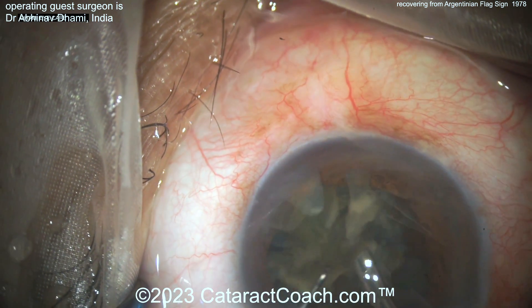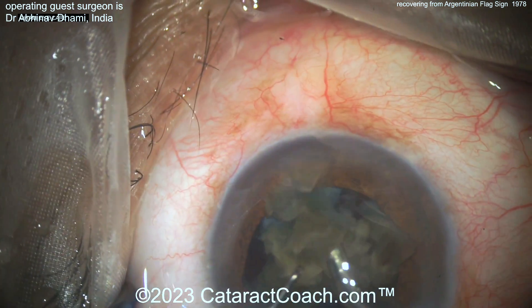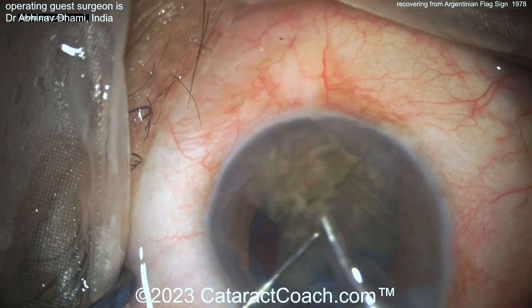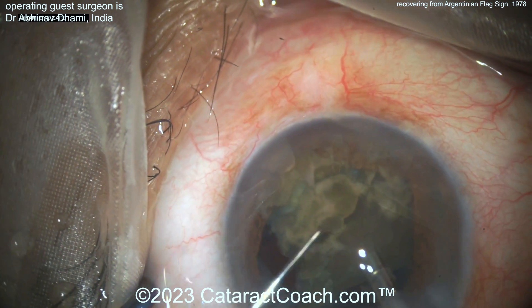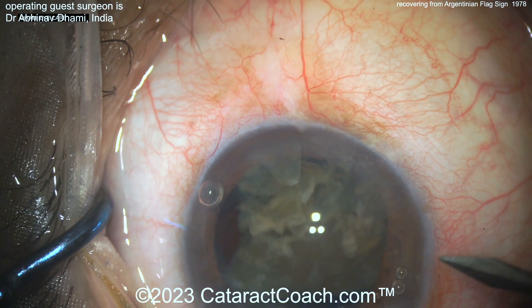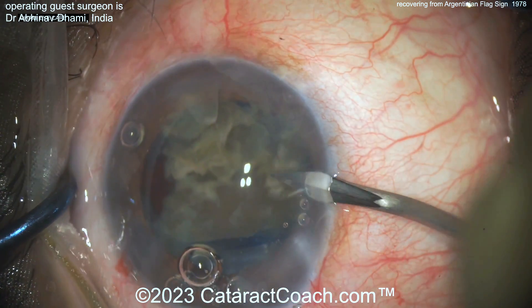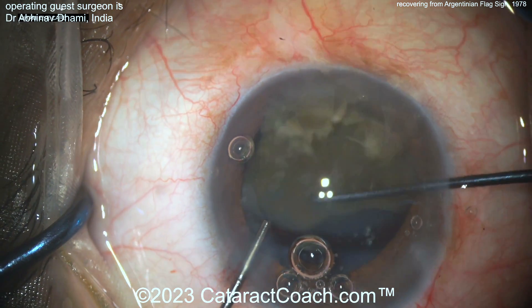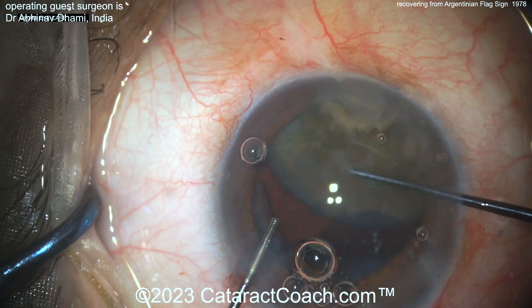I like the idea — get it out of the bag. Avoid placing stress on the bag; you really need to avoid that. Buzzing in again on these little pieces. There's a little fragment there kind of attached. Here's another incision — a para-incision just for access. I like that. Get it up out of the bag. Quit stressing out that poor bag.